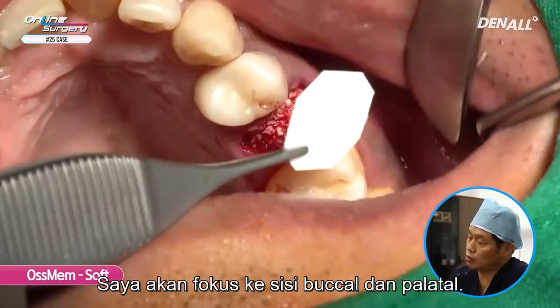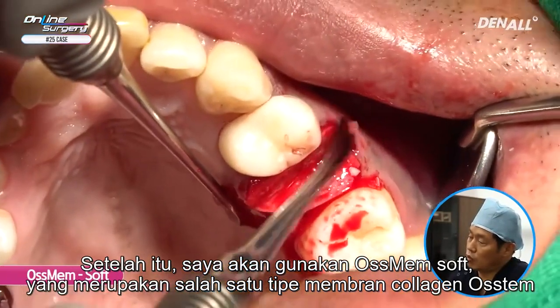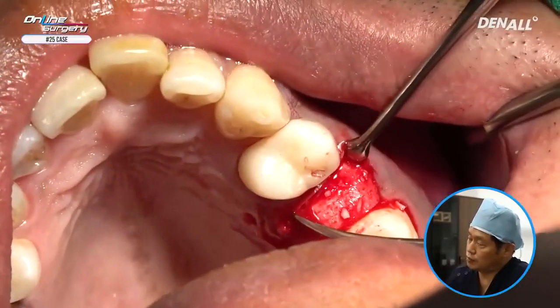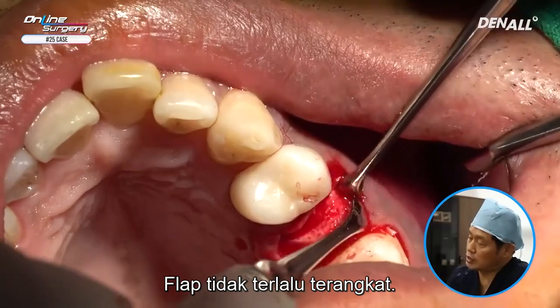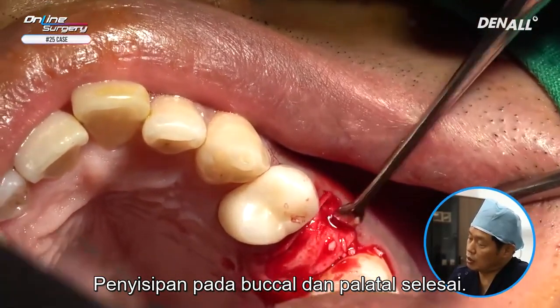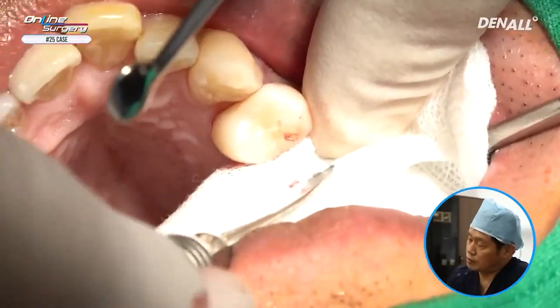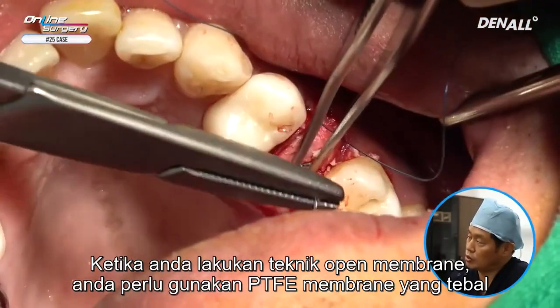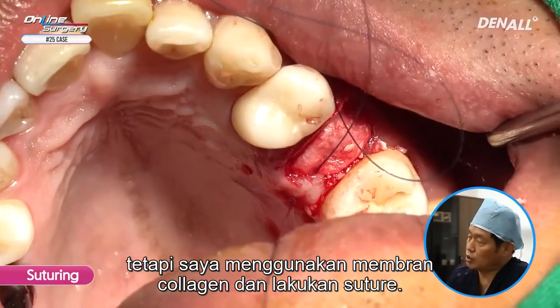I'm going to focus on buccal and palatal side. After that, I'm going to use Osmem Soft, which is the new collagen membrane from Osstem. Coverage is done superiorly. Flap has not been reflected much. Undermining on buccal and palatal is done. Osmem is positioned. When you do open membrane technique, you use dense PTFE membrane, but I just used collagen membrane and do suture.